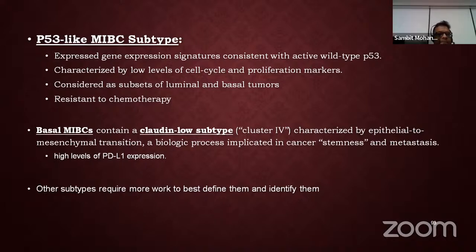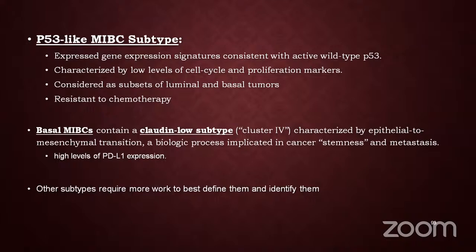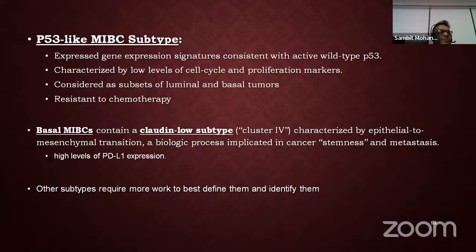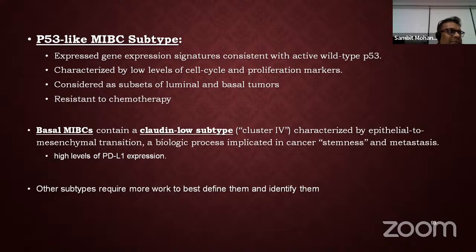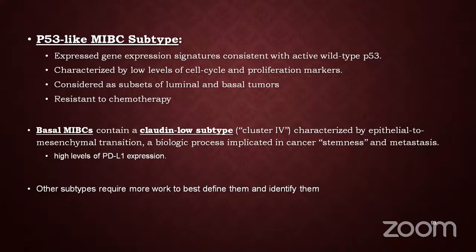Yes. And it is evident, it is clear cut, it is squamous cell. No, even if it is clear cut, I would not call it. It is morphologically... we can diagnose it as squamous. No, even then, what is a question which is very valid, and we almost struggled for 15 years to find a magic marker through various studies, but we failed because squamous and urothelium are very, very similar or the same in the immunophenotype. No immunostain is going to differentiate.